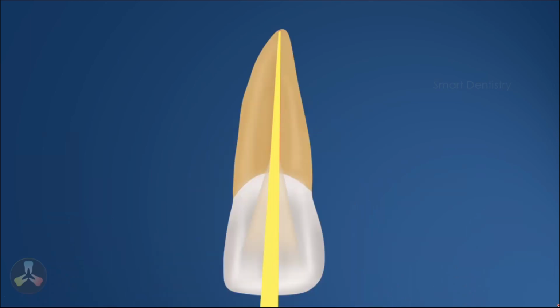back? Take a master cone, put it inside after cleaning and shaping, try to pull, it should never come immediately. There should be some form of resistance to it, and if you are pulling so much, it has to come. Giving a little pressure and pulling, it should offer some resistance at the root tip.